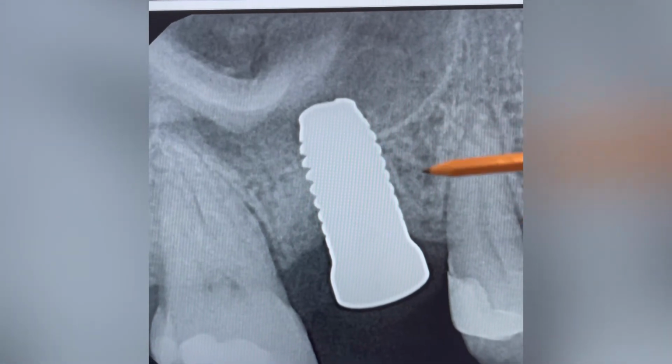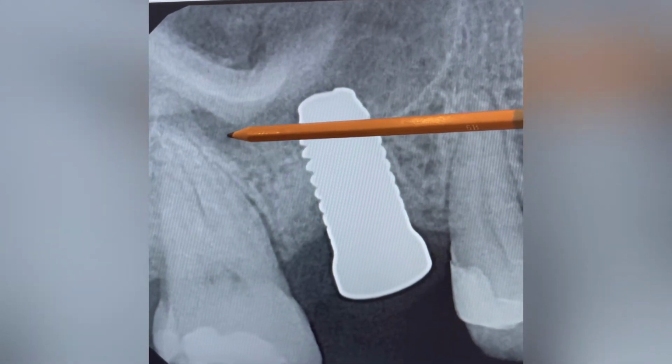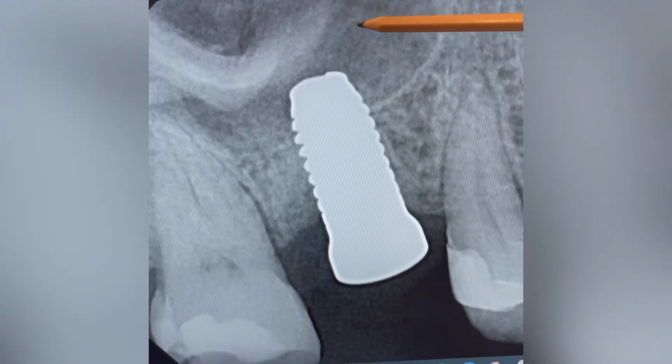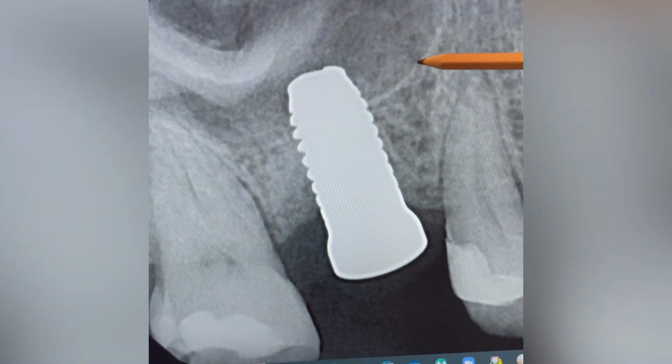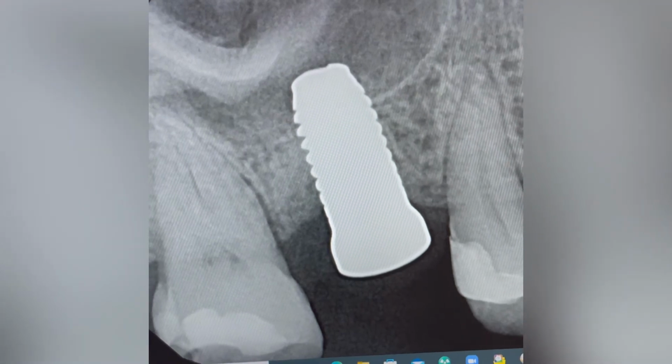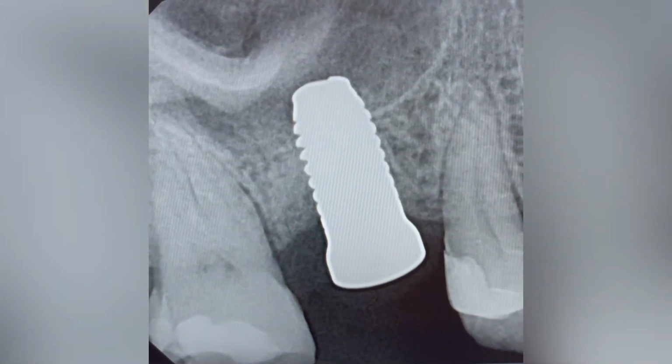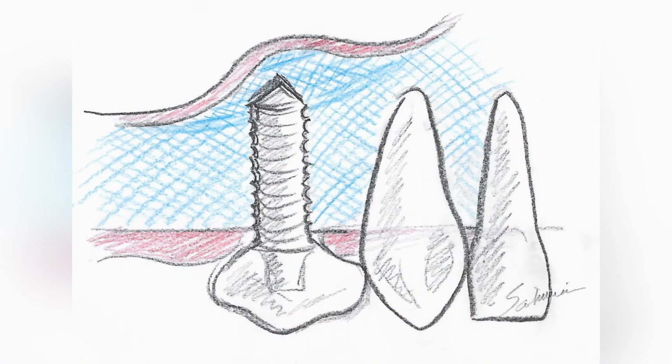In the final X-ray, we notice the faint outline of the sinus membrane dome, which is, of course, hardly visible because PRF does not show up in X-rays. In a few months, however, the PRF will turn into bone.